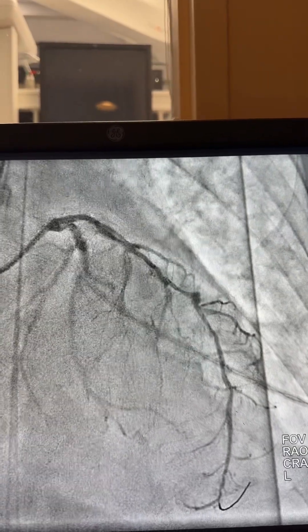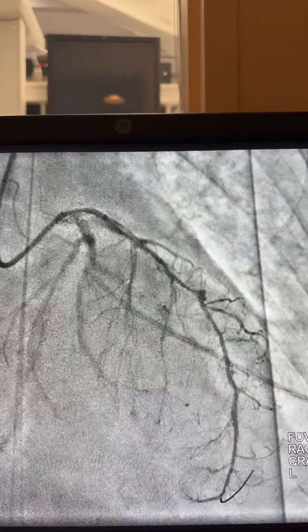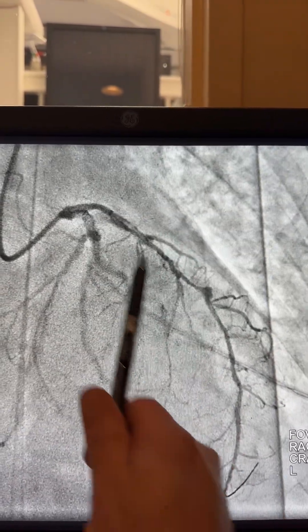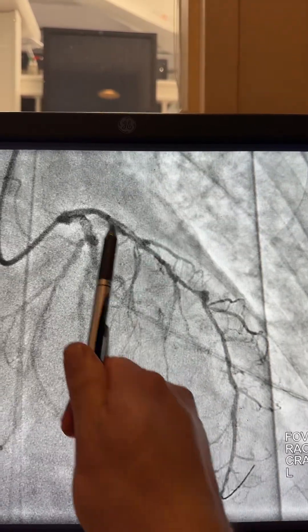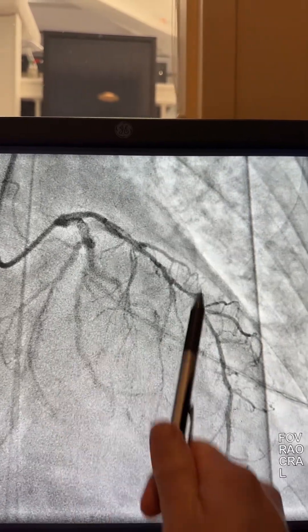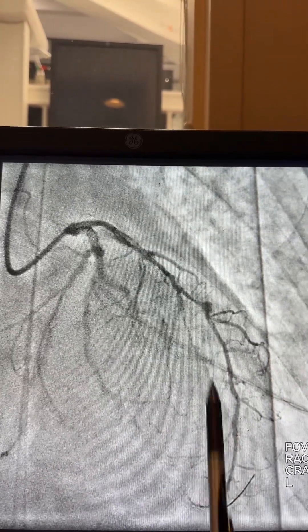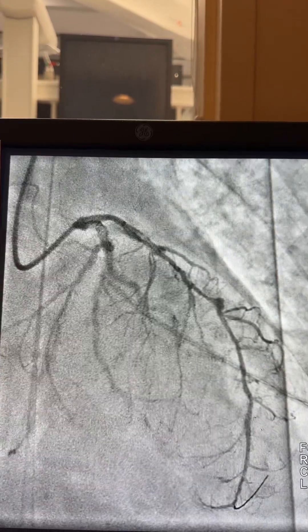In this situation you just have to be careful keeping the wire in place and make sure the tech is not going to pull the wire. Then we're going to do shockwave up to here, and then we're going to fix this area first to allow the guide liner to pass, and fix this area if we need to after we fix the proximal.